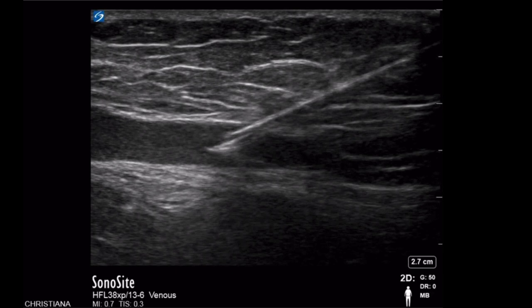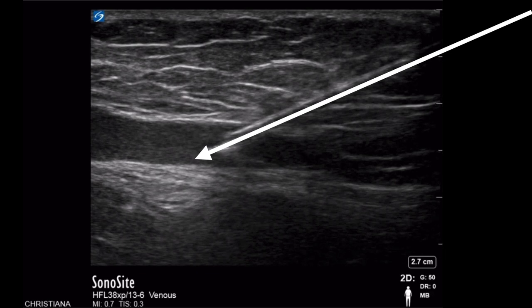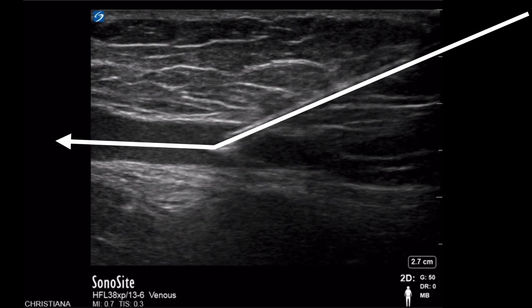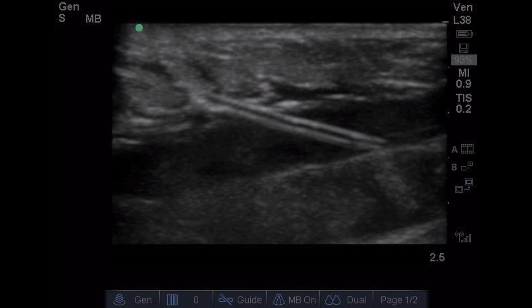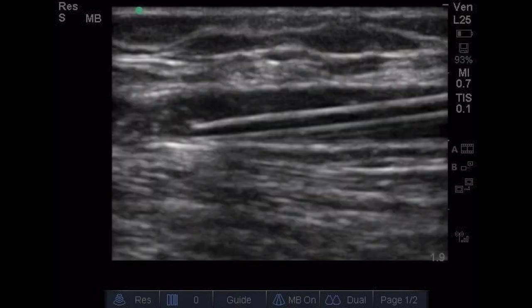To have a well-seated ultrasound-guided catheter that prevents extravasation or dislodgement, aim for about half the catheter length within the vessel. This means the catheter travels from the puncture site through soft tissue to the vessel, with half remaining inside the vessel. So for a 45 mm catheter, the distance from puncture site to vessel should be less than about 2 cm. If the catheter tip is just barely in the vessel touching the back wall, it is likely too short. If the catheter layers against the back wall within the vessel, there is adequate length.